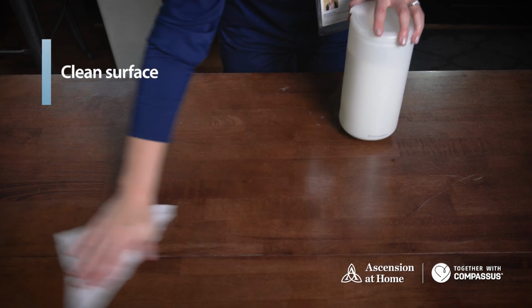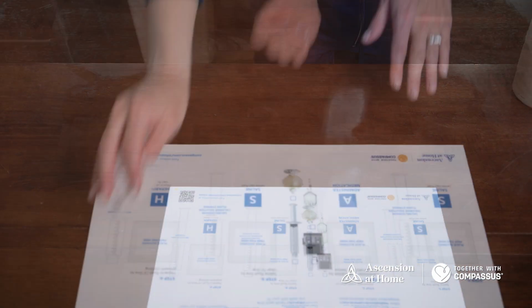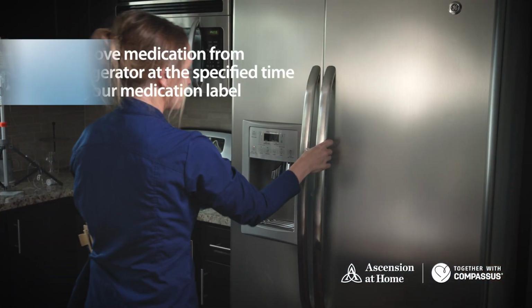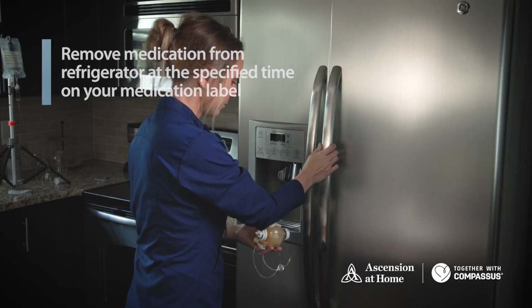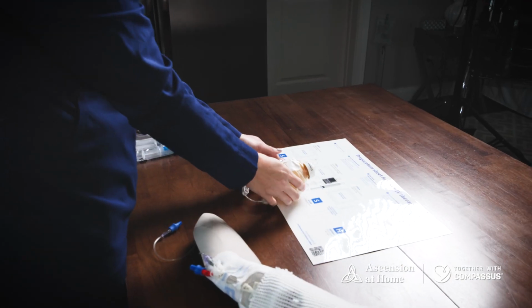Select a clean surface for your working area. Remove the medication from the refrigerator at the specified time on your medication label. Never speed the warming process by putting the medication in the microwave.